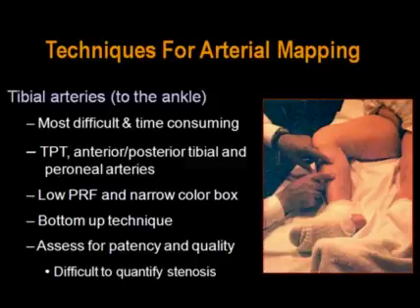In this area, we use a bottom-up technique, and that is we start evaluation by identifying the tibial arteries at or near the ankle. They tend to be relatively superficial here, and easy to image and visualize, and then follow those vessels up.